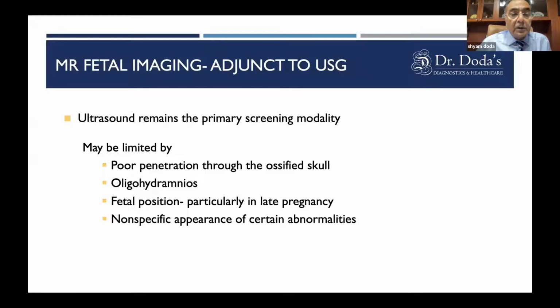There is absolutely no doubt that ultrasound remains the primary screening modality. But as everything in life has certain limitations, ultrasound is also limited by relatively poor penetration, especially when you have a large abdomen size of a woman who is pregnant, especially towards full term.